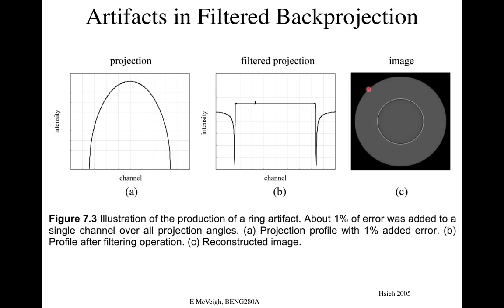Oh, shell. Of the edge of the bucket? Yeah, so normally these are called phantoms, and normally it's a Perspex cylinder. So it has its own Hounsfield unit on the edge, and you just live with it. Okay. Right? I could bring in some pictures of phantoms that are used each day.